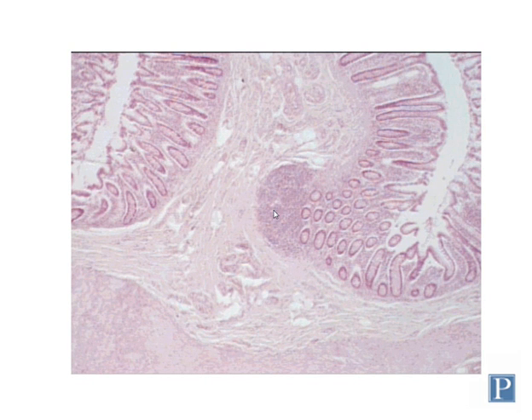First, let's look at some solitary lymphoid nodules, which are part of the diffuse lymphoid system. These nodules are collections of B lymphocytes and nearby T lymphocytes that can be found in the walls of many organs, particularly in the gut, but you can also find them associated with the respiratory tract and other structures as well.